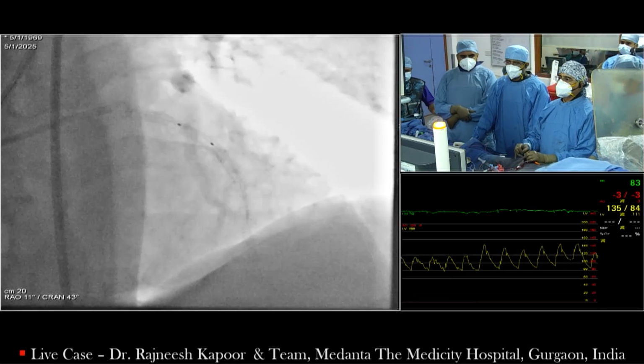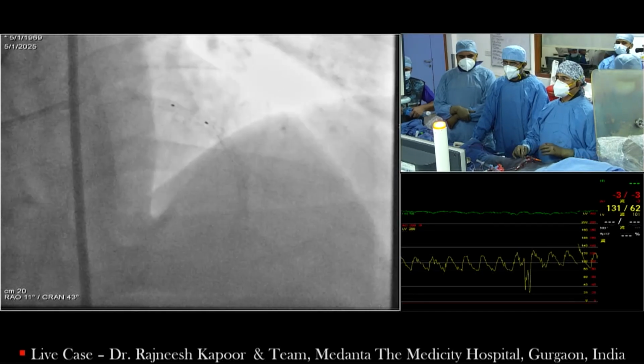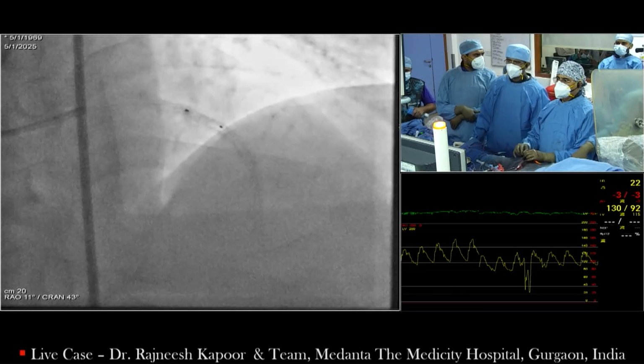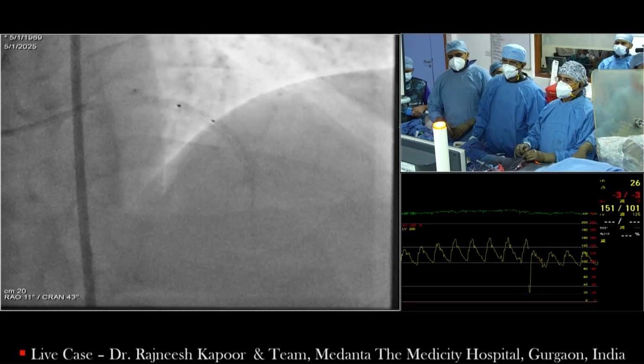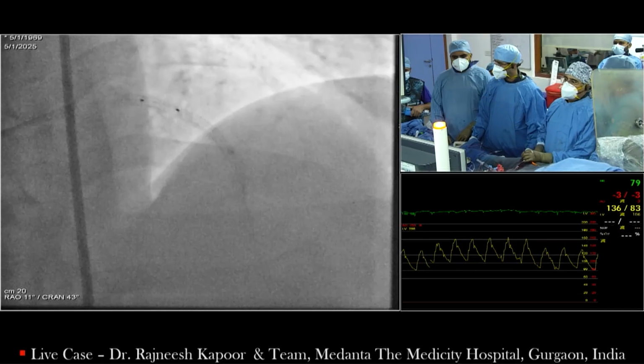The drug-eluting balloon we just spoke of. 18. Yeah. So Don, okay, making some comments, Don? No, I was just asking which company is that balloon from that you were just speaking of? Protege? Uh-huh. I also don't know. Rajneesh, what company makes Protege?